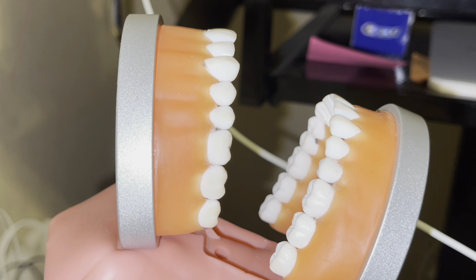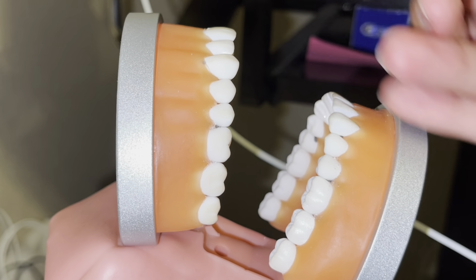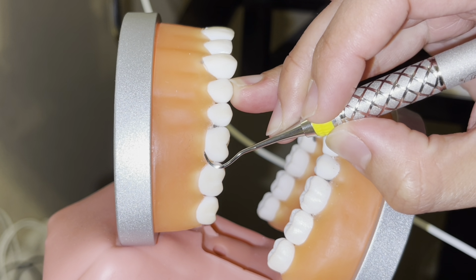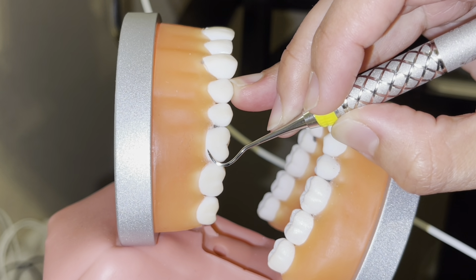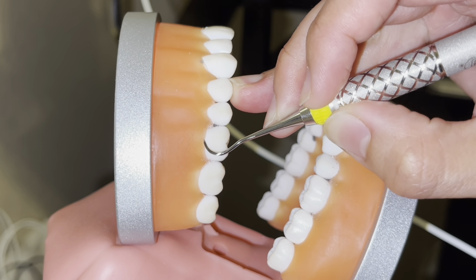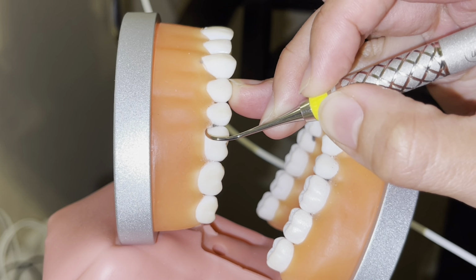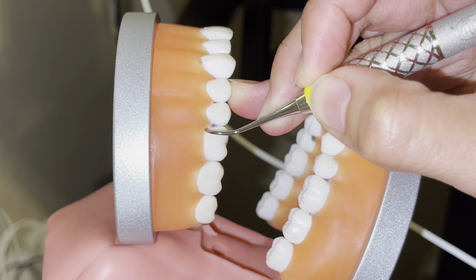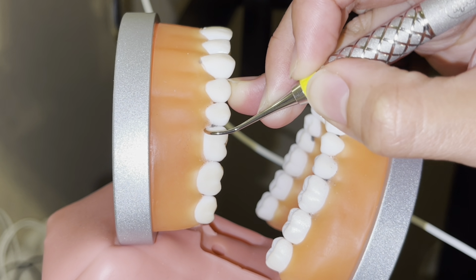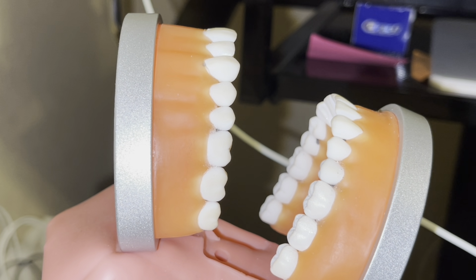and then turn your instrument halfway, walk your instrument towards the mesial, and oblique strokes, lift the wrists, up, down, pivot roll, up, down, pivot roll, and in the interproximal, up, down. Same thing for tooth number 4.